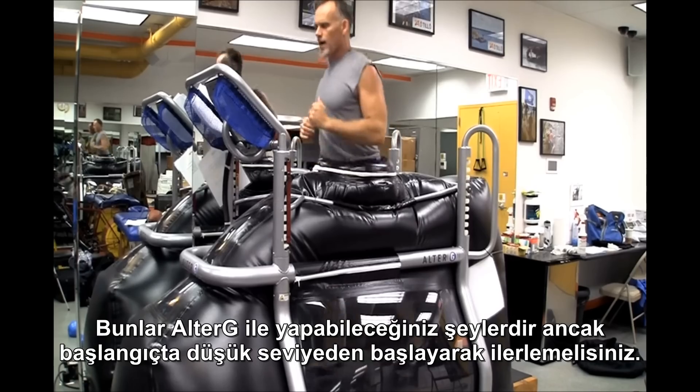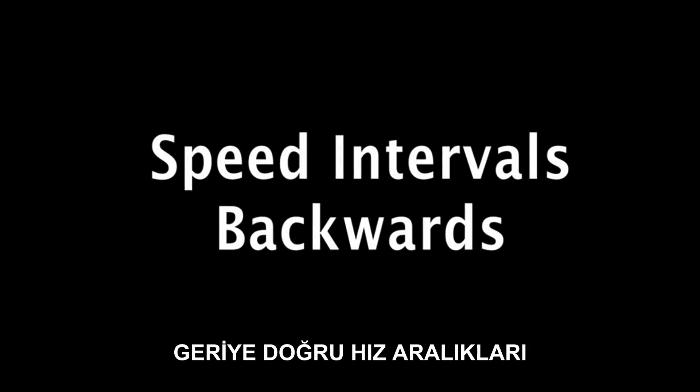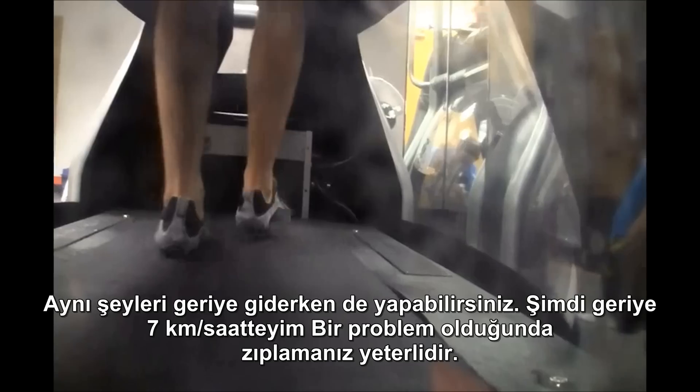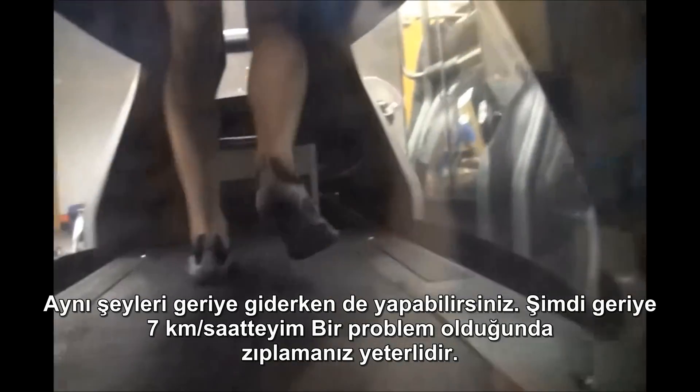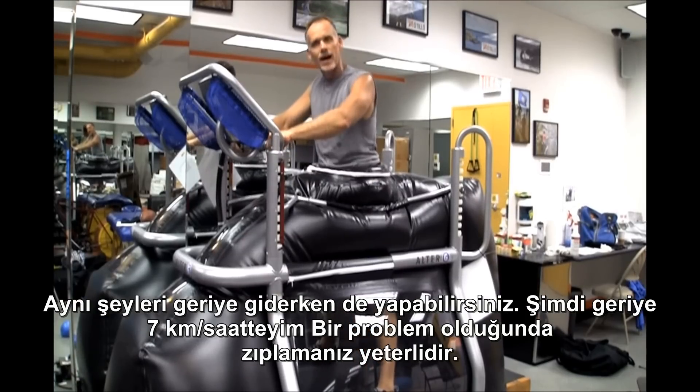Make sure that you start off at a low level and work on these things. You can do the same thing backwards. I'm at 7 miles per hour right now. If I have a problem, I just hop off.